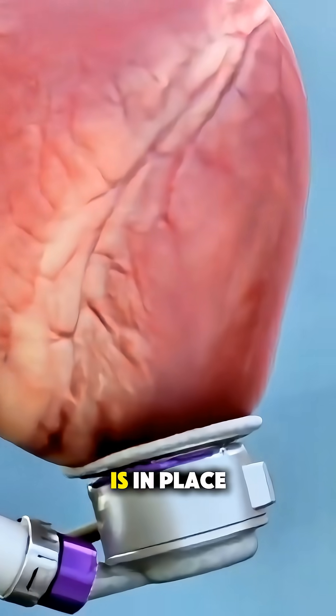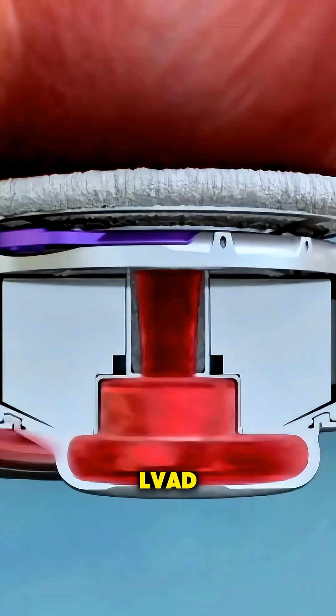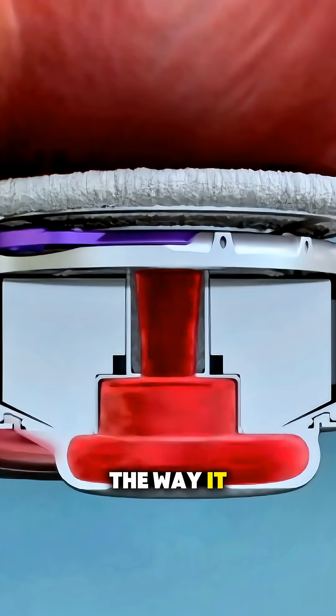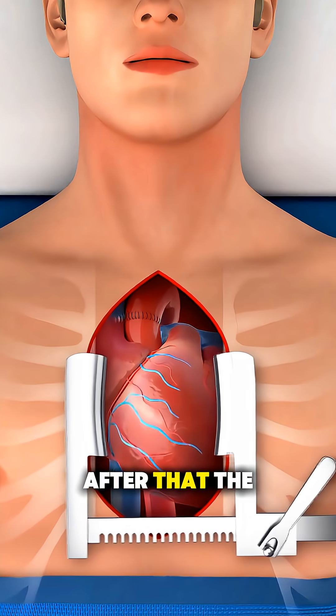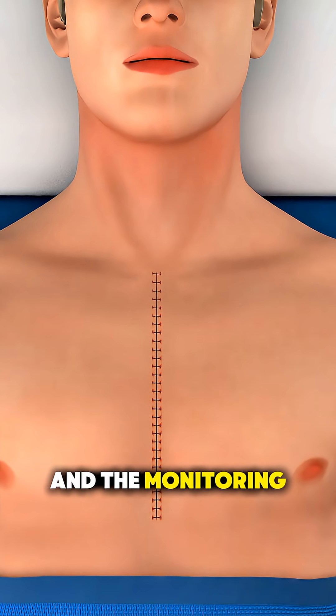Once the device is in place and all connections are secured, the team carefully checks that the LVAD is working smoothly and supporting circulation the way it needs to. After that, the chest is closed, the patient is moved to recovery, and the monitoring begins.